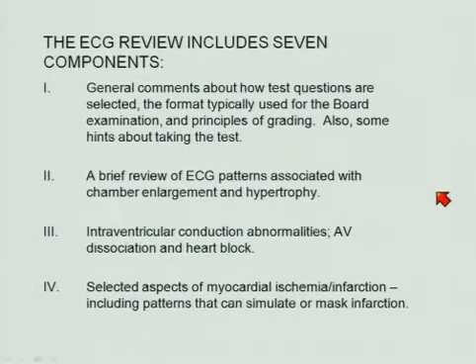Over the next few days, there will be 7 components to the ECG review. First of all, this morning I'm going to begin with a few comments about how test questions are selected, the format typically used for the board examination and the principles of grading, and some hints about taking the test. And then we're going to talk about a brief review of ECG patterns that are associated with chamber enlargement and hypertrophy, focusing on right ventricular hypertrophy since you see LVH all the time.